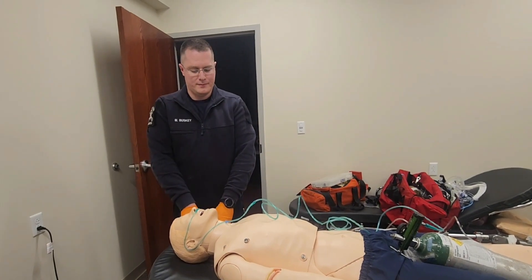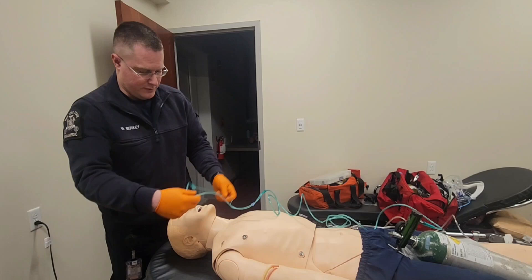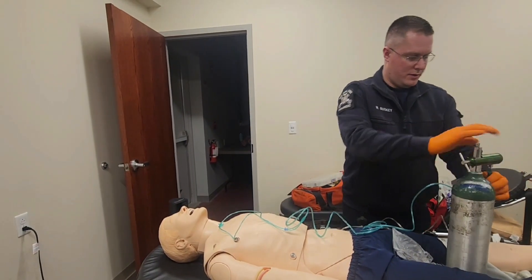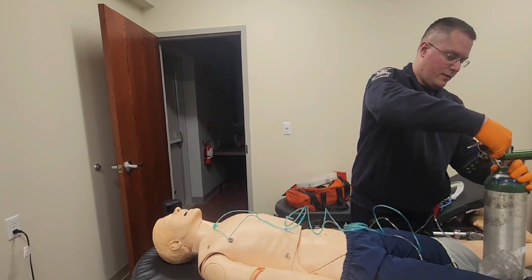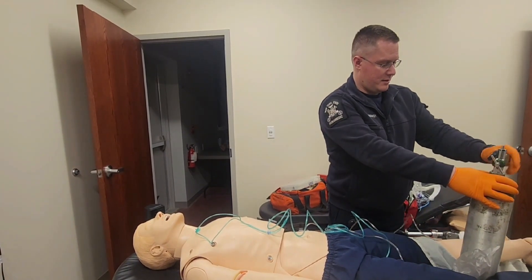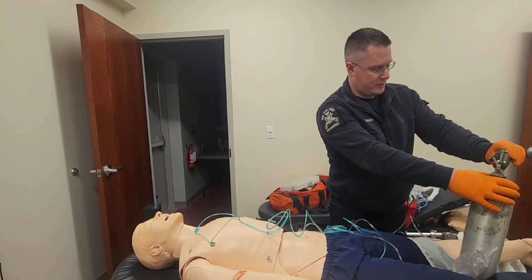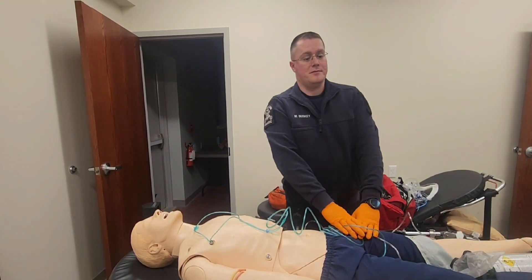Please discontinue oxygen therapy. I'll then take the nasal cannula off and shut off my flow. I'm going to close the oxygen tank and relieve the pressure inside of the tank. Pressure is relieved, and I'm done with the station.